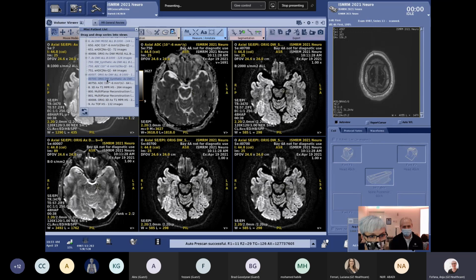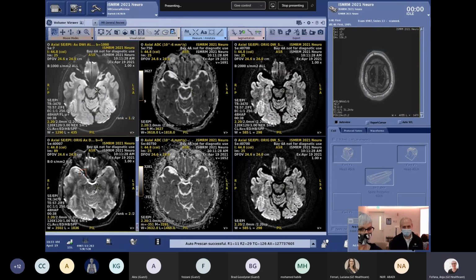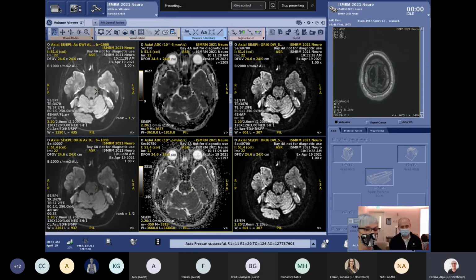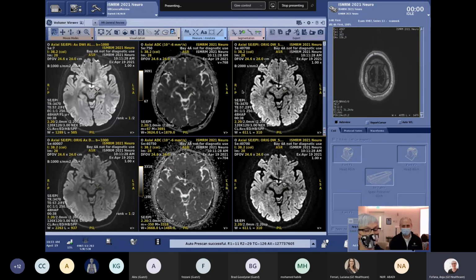Sorry, that was the wrong viewer. Yeah, I think I don't have to say anything, right? Change that one in the bottom left to the b1000. Yeah, there. There we go. Right. So nice to not have the noise anymore. Mhm. And here we see the scan time, 38 seconds. 38 seconds for a very high resolution diffusion scan. It's great.